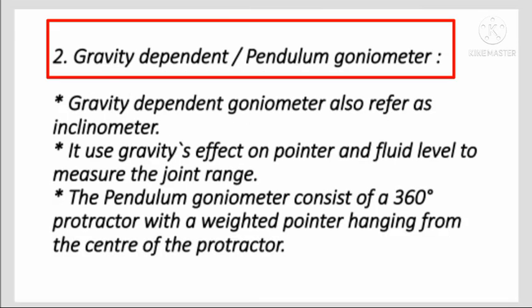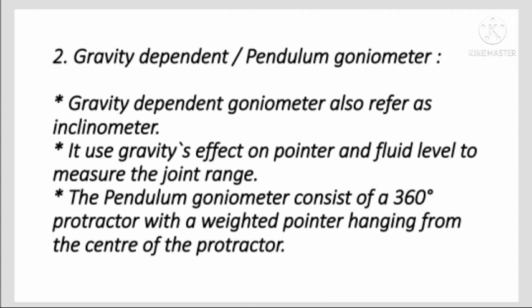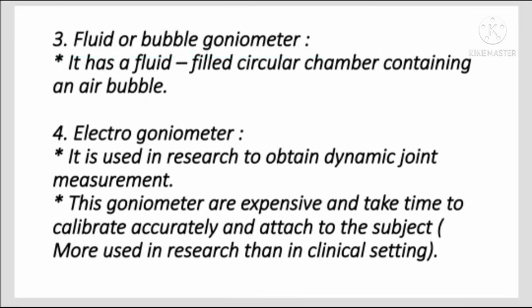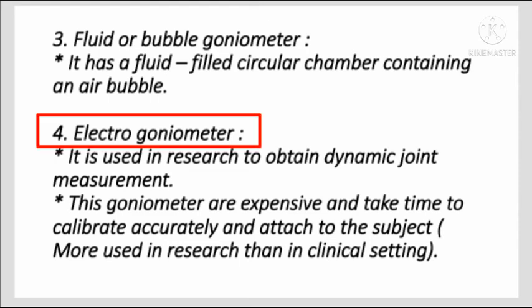Gravity-dependent or pendulum goniometer. The gravity-dependent goniometer is also referred to as an inclinometer. It uses gravity's effect on the pointer and fluid level to measure the joint range. The pendulum goniometer consists of a 360-degree protractor with a weighted pointer hanging from the center of the protractor. Fluid or bubble goniometer: it has a fluid-filled circular chamber containing an air bubble.